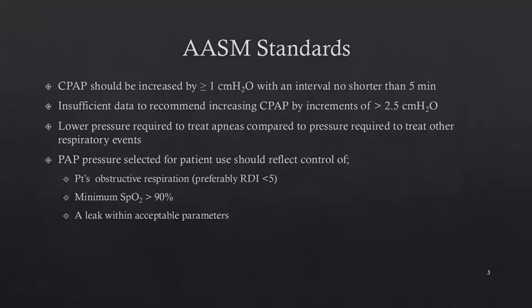As CPAP is increased, you'll typically see that apneas are eliminated first during the titration, hypopneas following, then RERAs, and eventually snoring. Not always the case, but oftentimes you'll typically see it go that way.